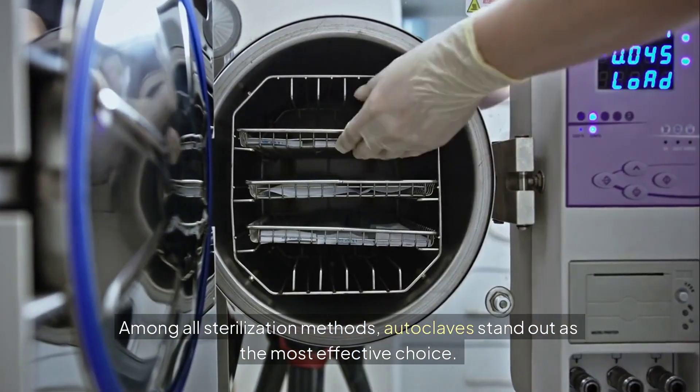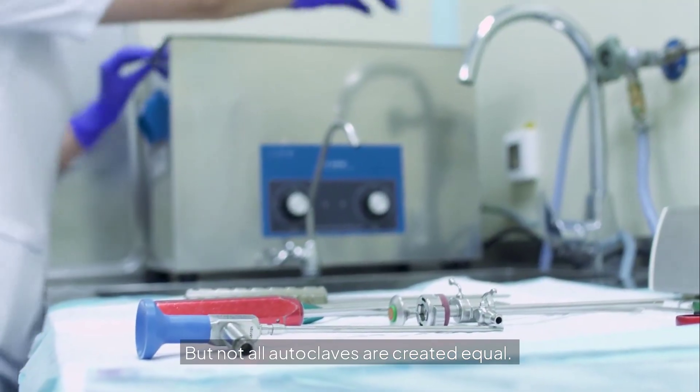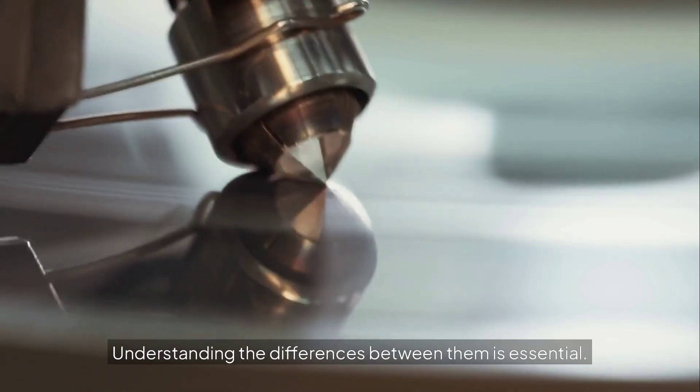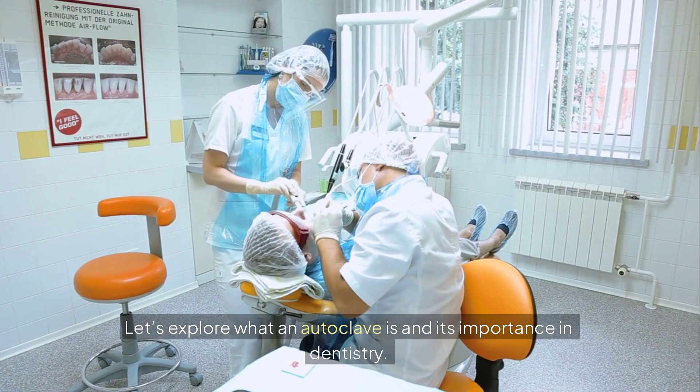Among all sterilization methods, autoclaves stand out as the most effective choice. But not all autoclaves are created equal. Understanding the differences between them is essential. Let's explore what an autoclave is and its importance in dentistry.